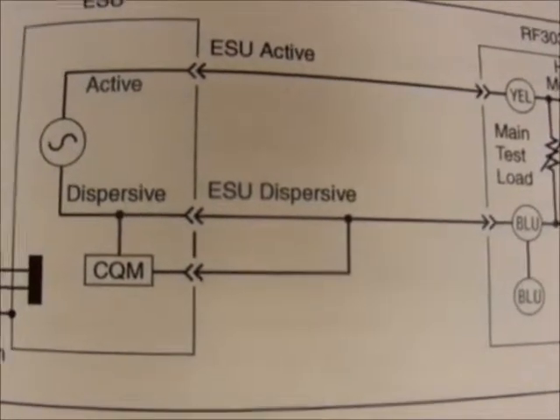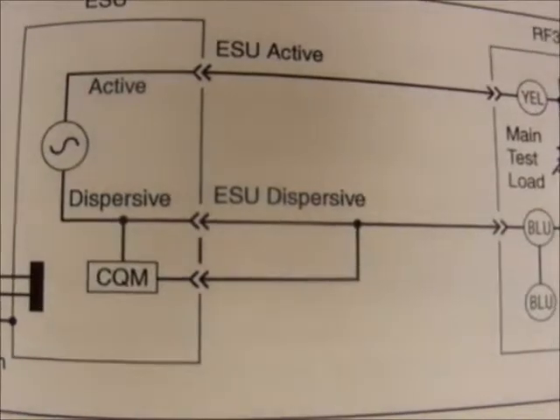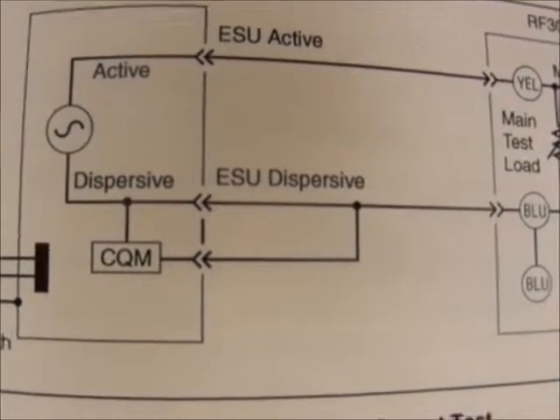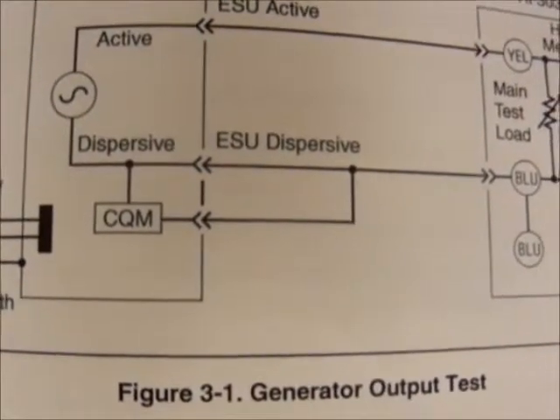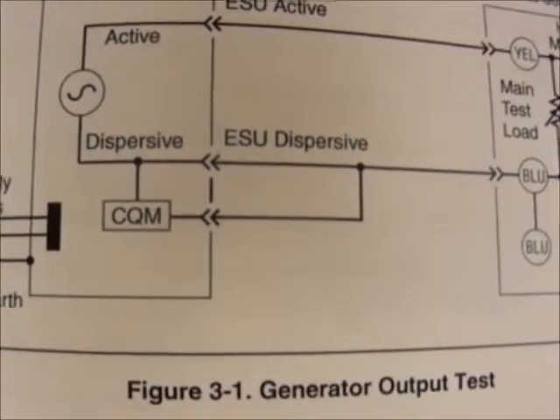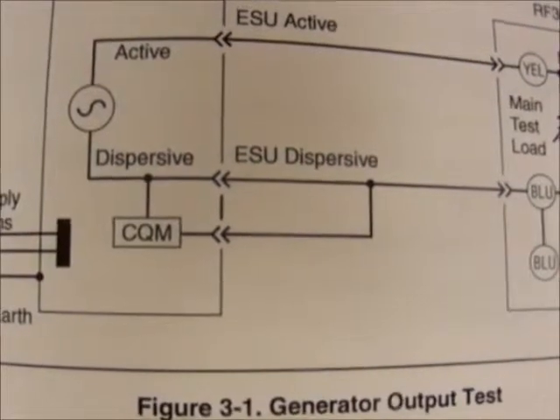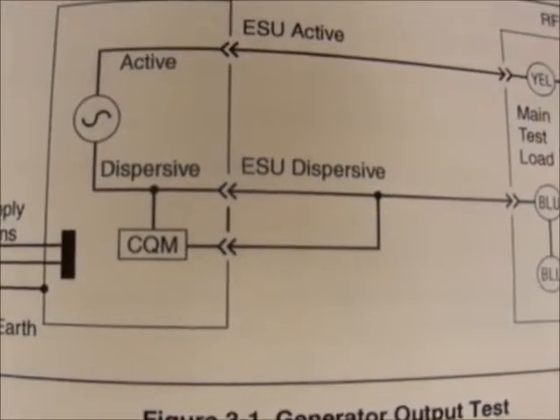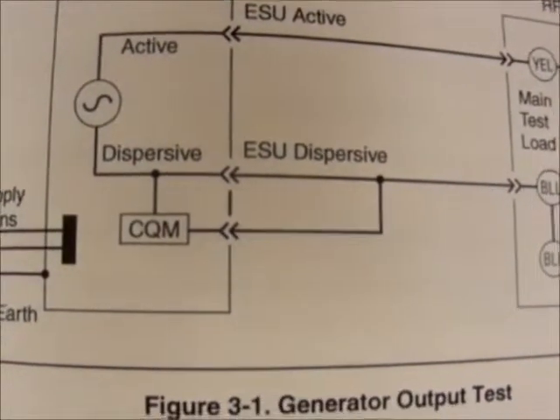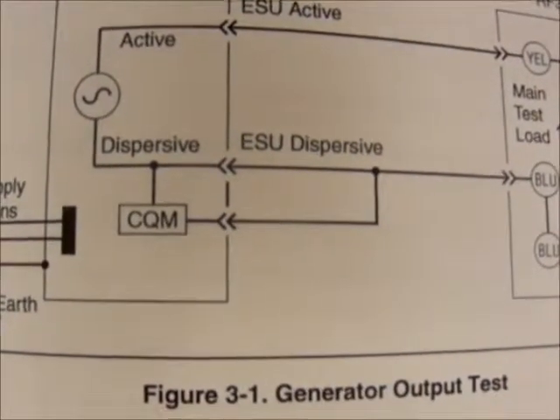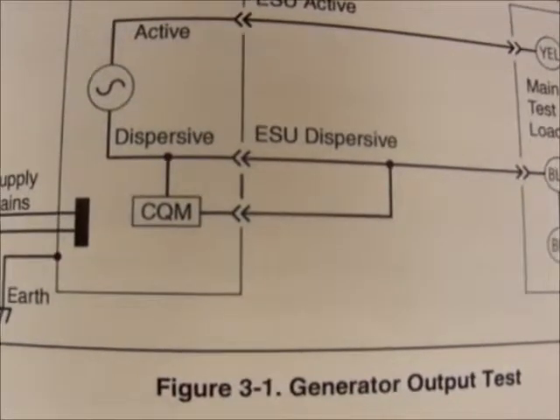A 500 ohm test load simulates body impedance, or AC resistance, of a patient or operator on the low side, while the 750 ohm simulates a high side.